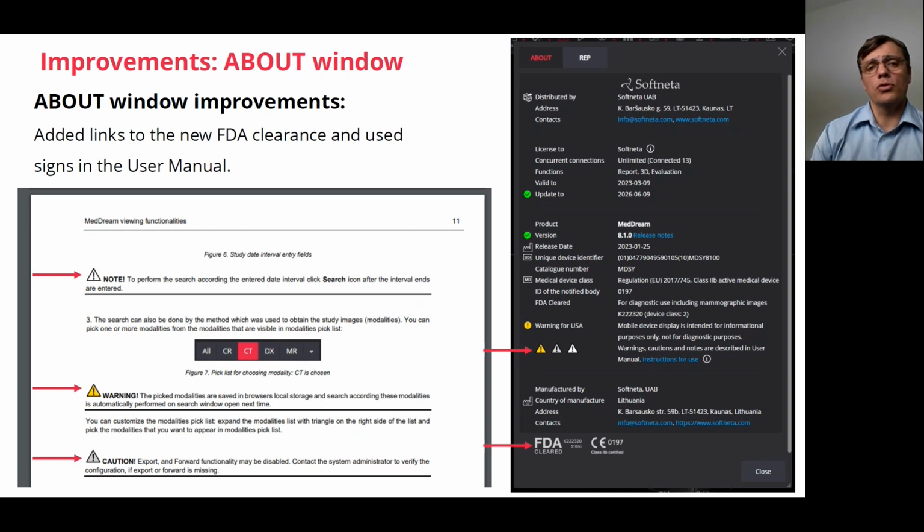It automatically explains that these displays are not diagnostic ones, and you are not able to achieve diagnostic quality on them. So you need to take care about which tools you use for which purposes.